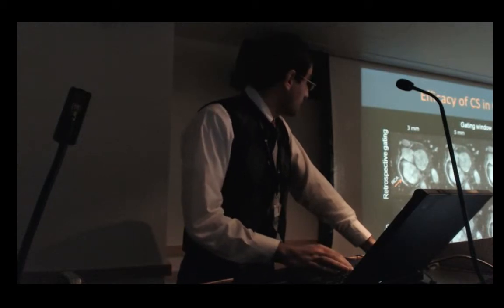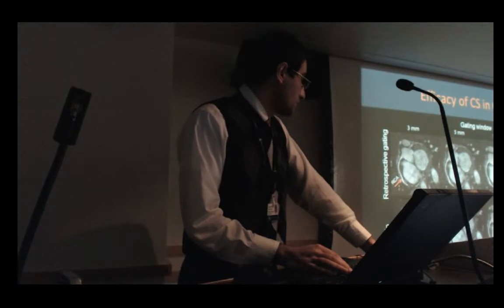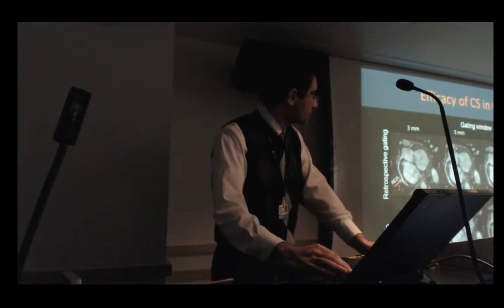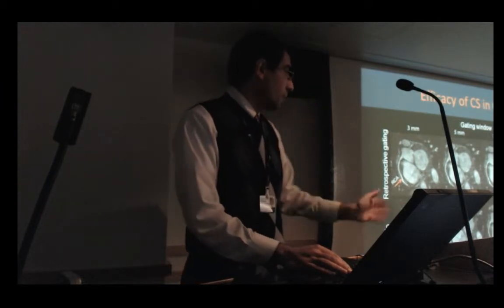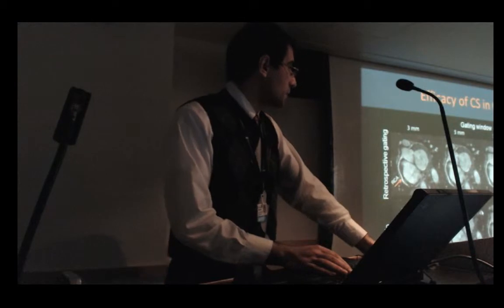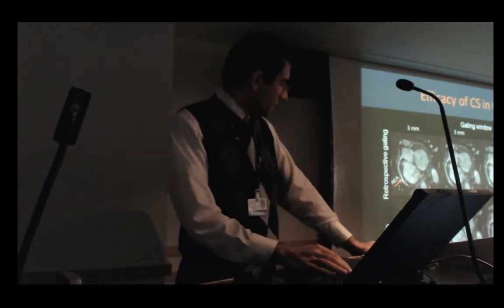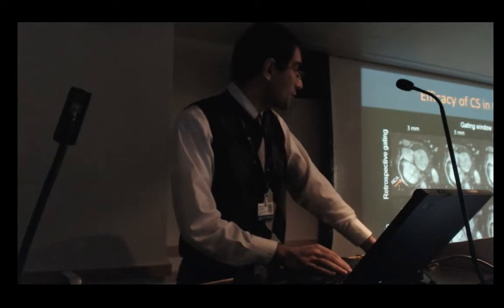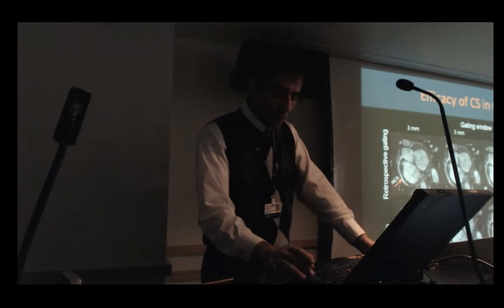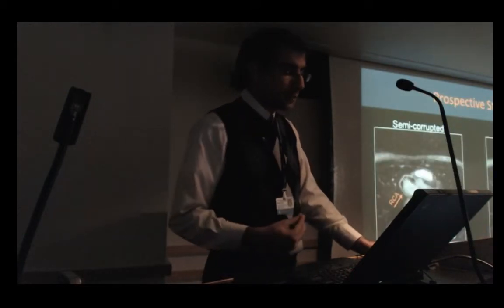In the next step, we retrospectively corrected for the respiratory motion of all 10 volunteers within different gating windows of 3, 5, 7 and 10 to have a reference, and then we used the compressed sensing algorithm to estimate the images and compare them with the retrospectively gated images. As you can see, the right coronary artery is very well delineated in COSMO, and the images are very comparable.